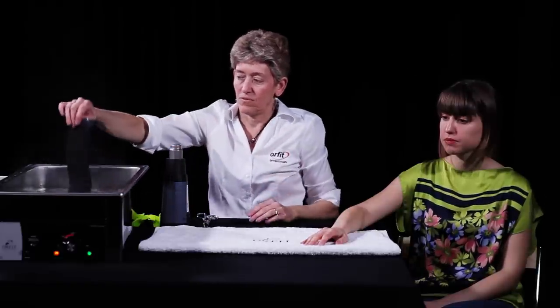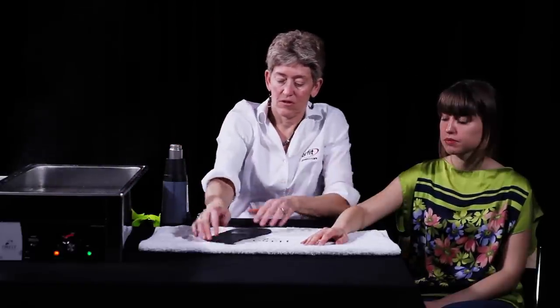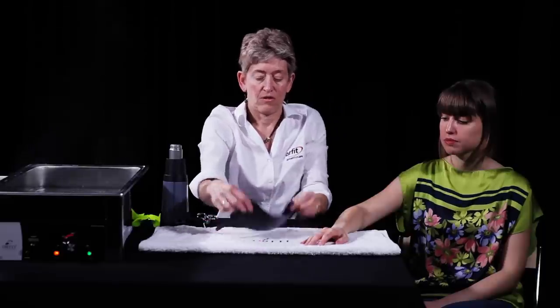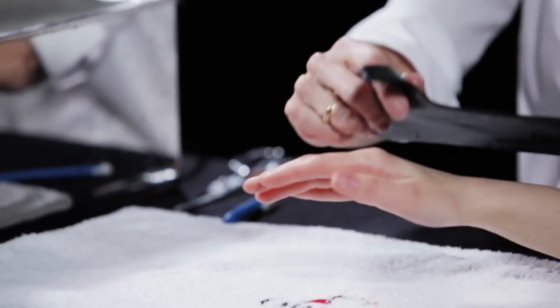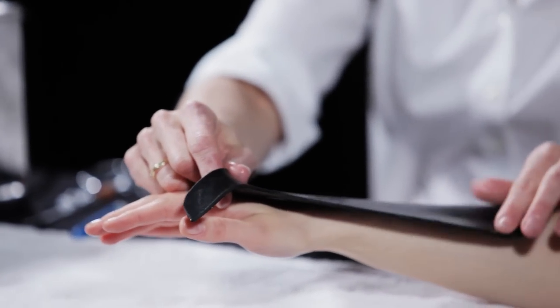Remove the orthosis from the water bath and dry briefly to remove the excess hot water. Position the orthosis on the dorsum of the patient's hand from the MCP joints to the forearm.